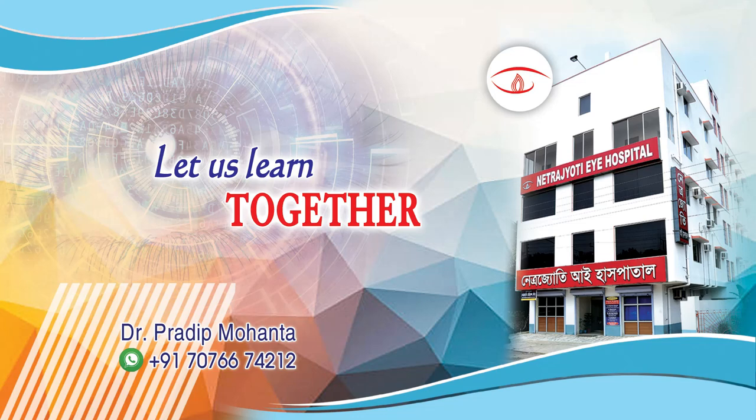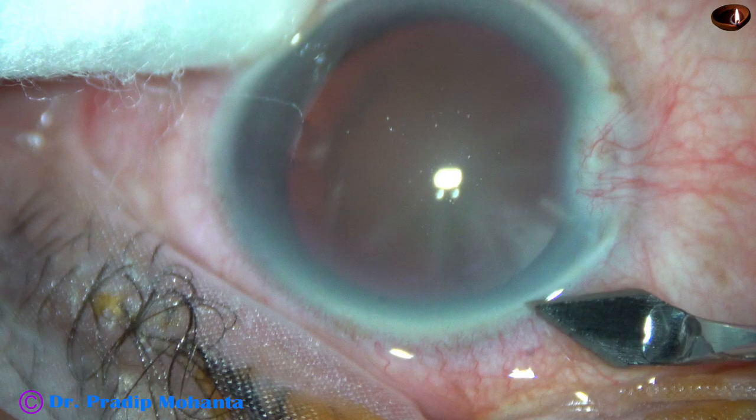Friends, welcome to my workplace at Ranaghat, West Bengal, India. In this video, I am going to demonstrate a 2.2mm FECO.